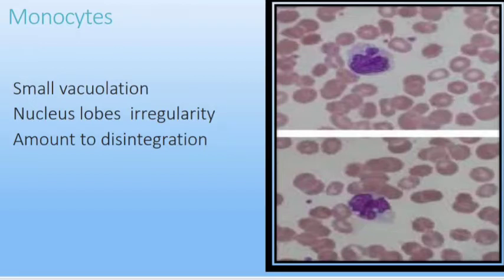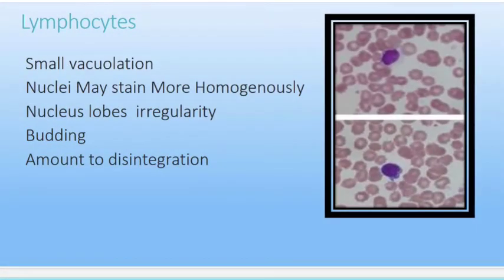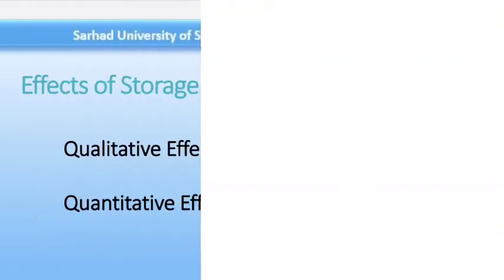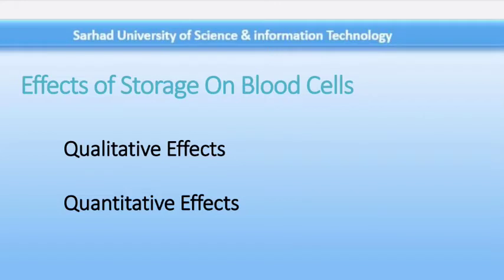Lymphocytes undergo similar changes. A few vacuoles may be seen in the cytoplasm, and nuclei stain more homogeneously than usual. In some cells, the nucleus undergoes budding, giving rise to nuclei with two or three lobes. These changes must be distinguished from apoptosis, which is natural cell degradation owing to programmed cell death. These were the changes observed in white blood cells: neutrophils, lymphocytes, and monocytes.